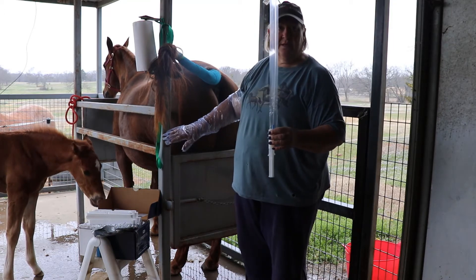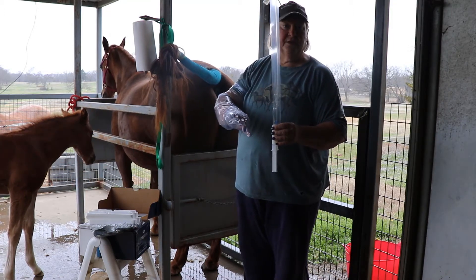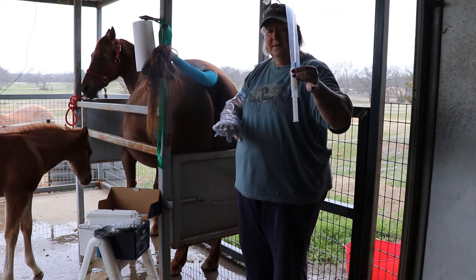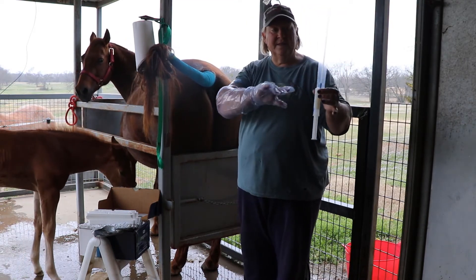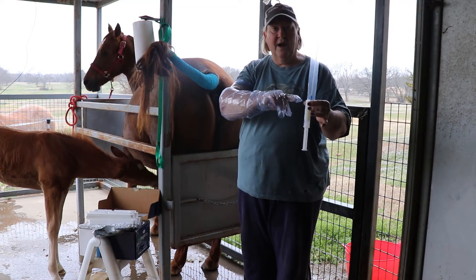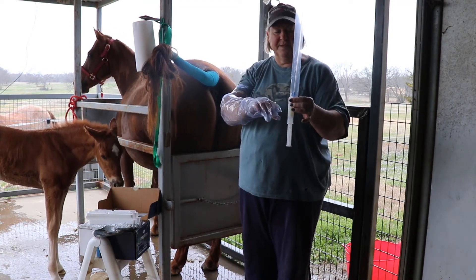We've got sterile lubricant, again different than just the standard lube that we use. The pipette is in a sterile wrapper that we will take off as we're inserting this into the mare.